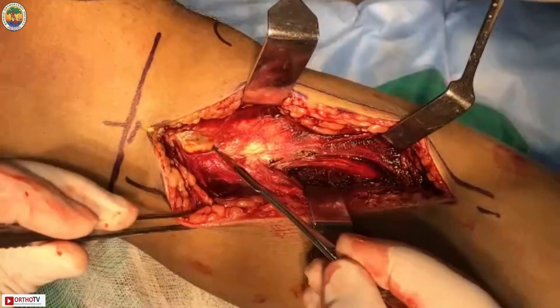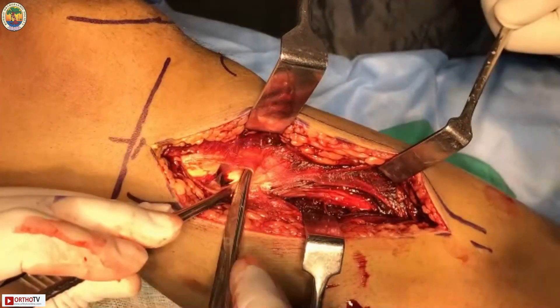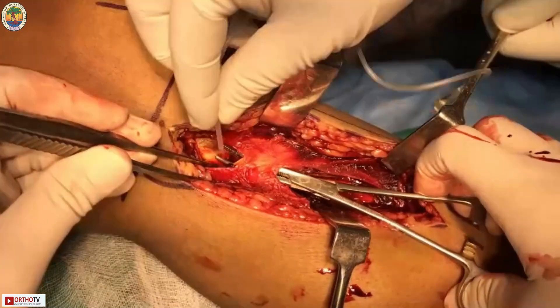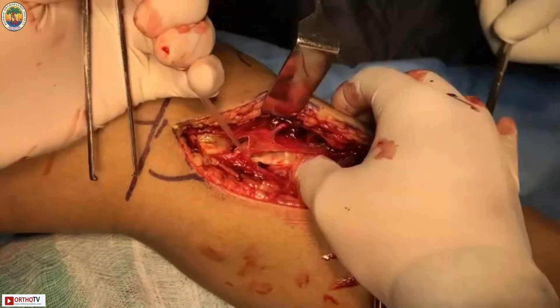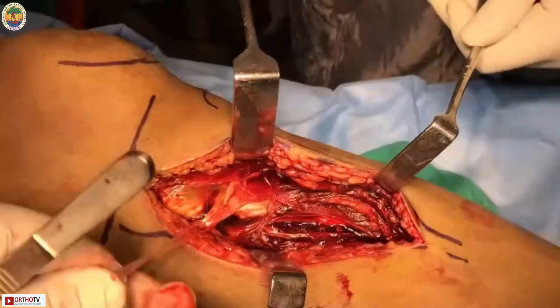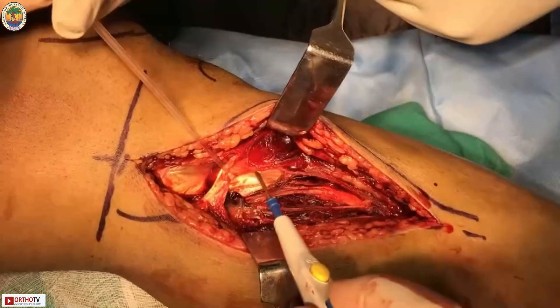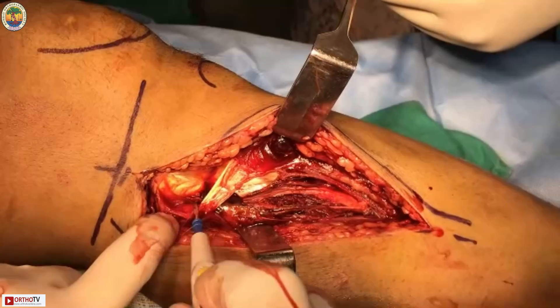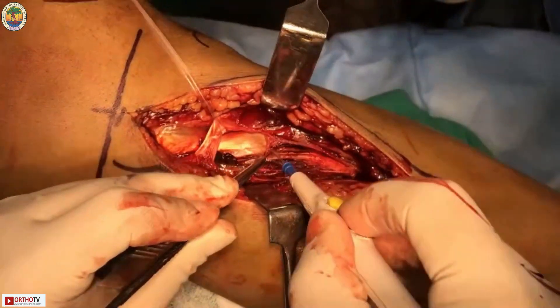The fascia is cut, and the gracilis muscle is identified and isolated separately. The sartorius fascia is identified anteriorly and posteriorly as needed. The medial collateral ligament is visible as the shining structure coming from above.